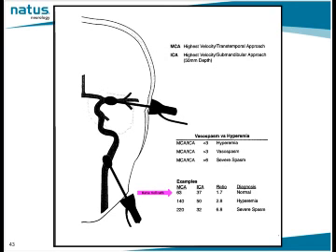Now, in a patient who went into vasospasm, and now they're treating the patient by pharmaceuticals to raise their blood pressure, more volume expansion type drugs also. The question is, is their vasospasm getting worse, or do they have a hyperemic increase in flow? So let's look at this example here.